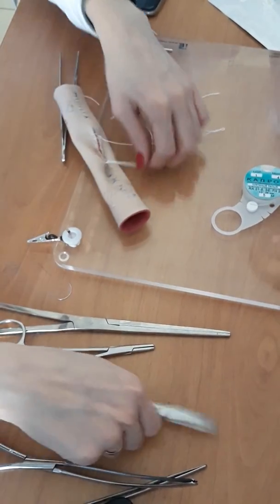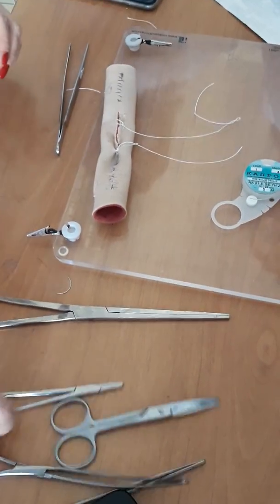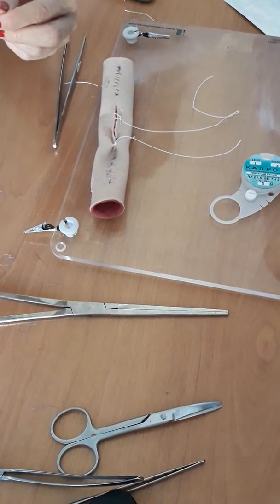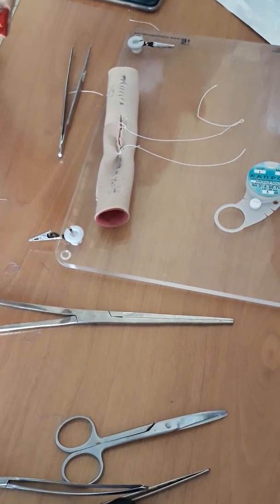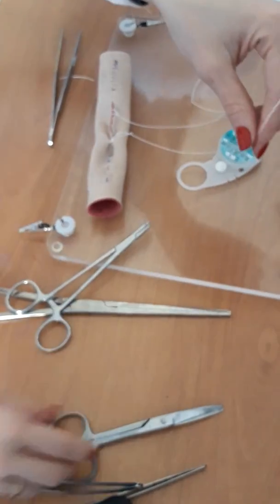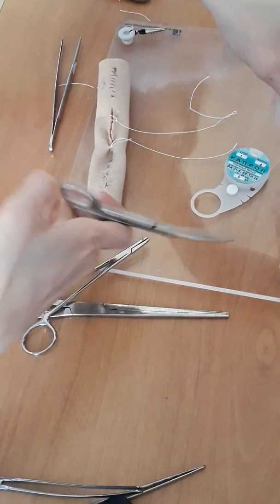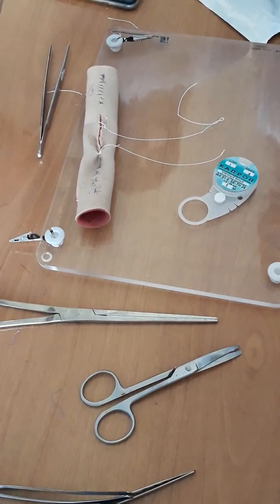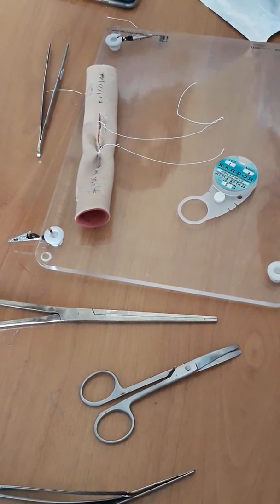Okay. After that, you should make the second Lembert suturing. Take the filament, 10 centimeters, not more, and make a second.